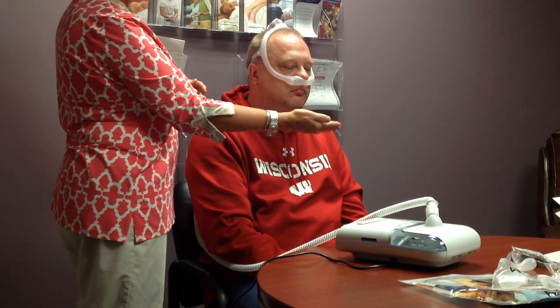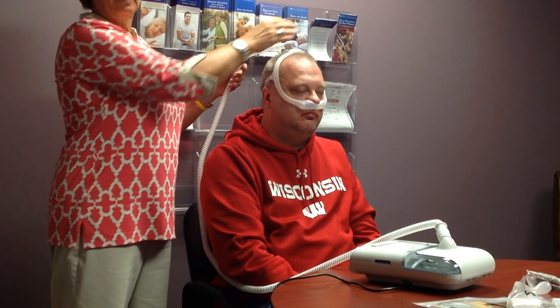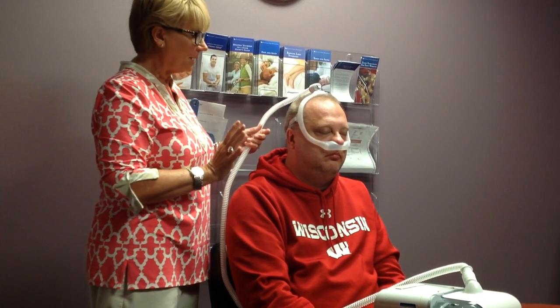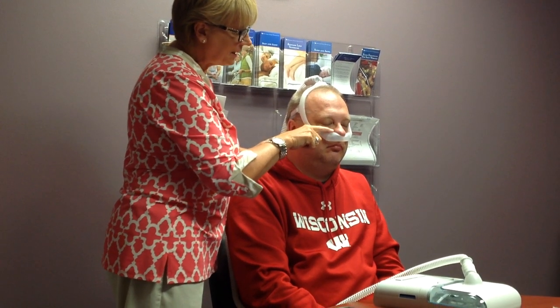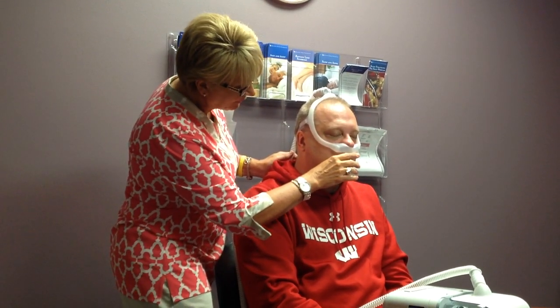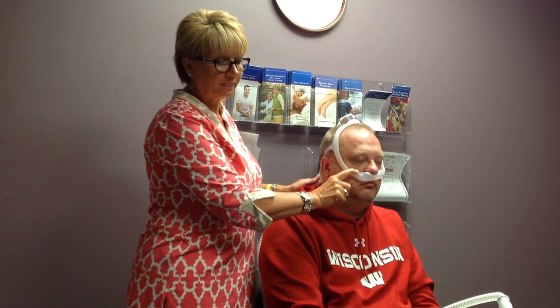Once you have everything turned on and your mask on, you'll know if there's any leakage. It's normal to feel air coming out at the front — you can take your hand and go like this, and that is normal. Up here is an exhalation port; air is supposed to come out here, so don't worry about that. Where you don't want to feel air coming is into your eyes — just take your finger and go around the nose and feel if there's any leak. If there isn't, you're good to go. You will usually hear the sound of a leak if there is one.